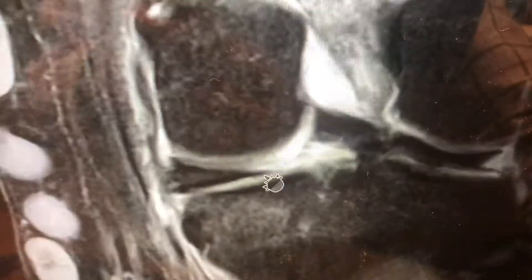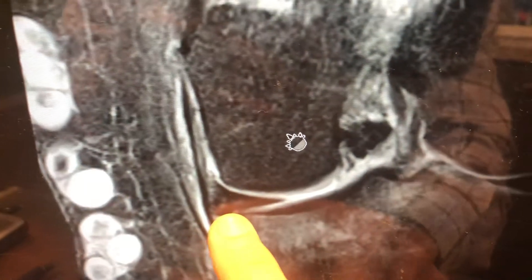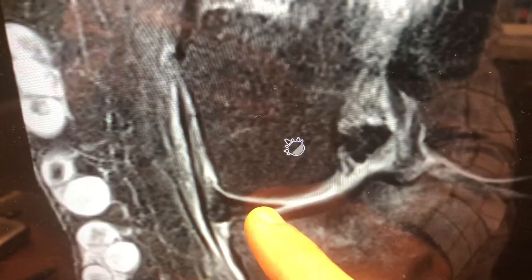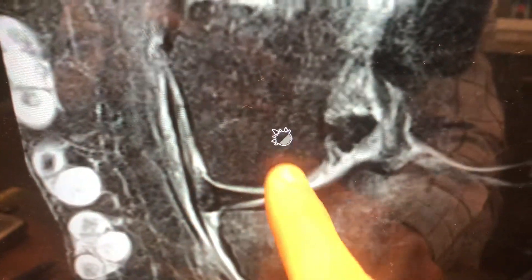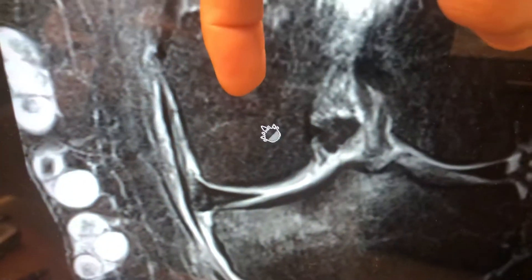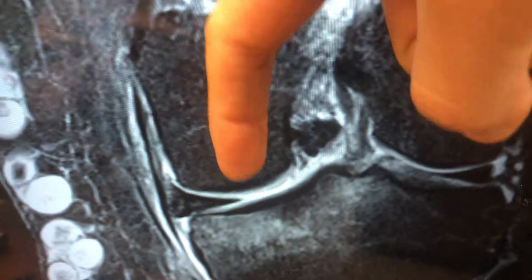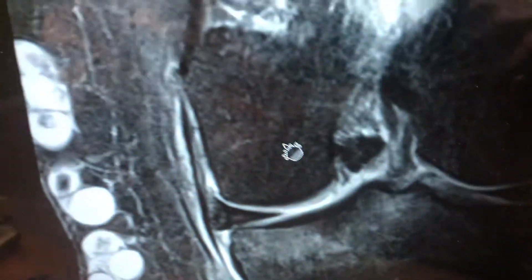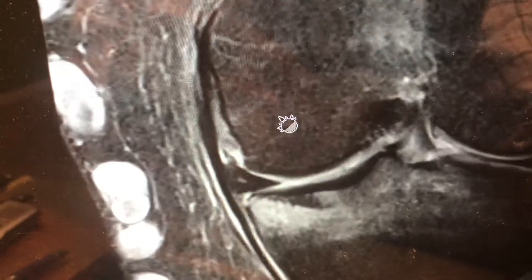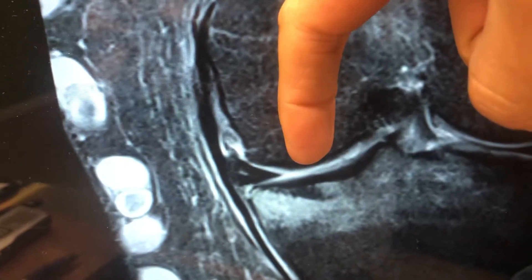As soon as the meniscus tore away in the back, it led to the meniscus displacing slightly more medial. What that does is it causes increased pressure from the bone — from the femur bone — onto the tibia. And that femur bone pushes down on the tibia. It's almost like a compression fracture.